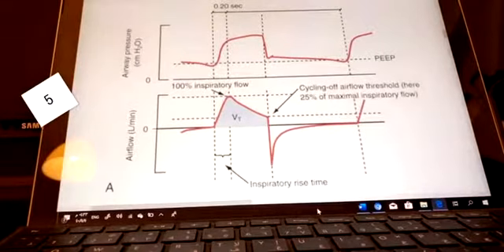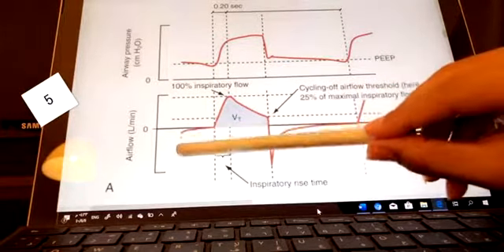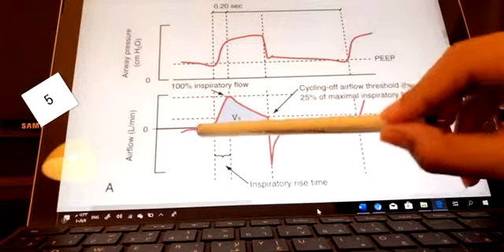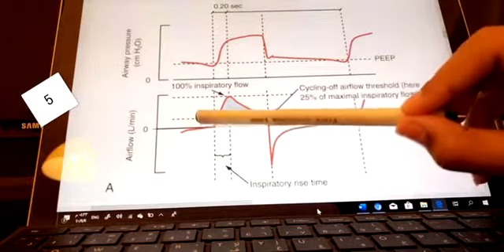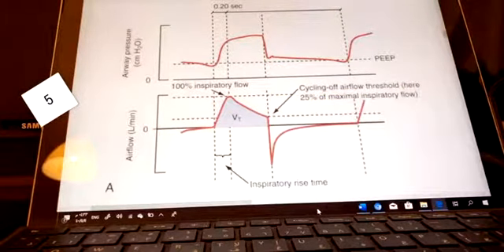Now we reach the point of how pressure support ventilation works. زي ما قلنا ال pressure support mode هو عبارة عن مود يحتاج إنه ال patient initiate or trigger each breath on his own. So when the patient inhales and generates inspiratory flow, the ventilator will sense the drop in the flow and rapidly deliver my preset inspiratory pressure, أو نقدر نقول pressure support 10, 12, whatever.